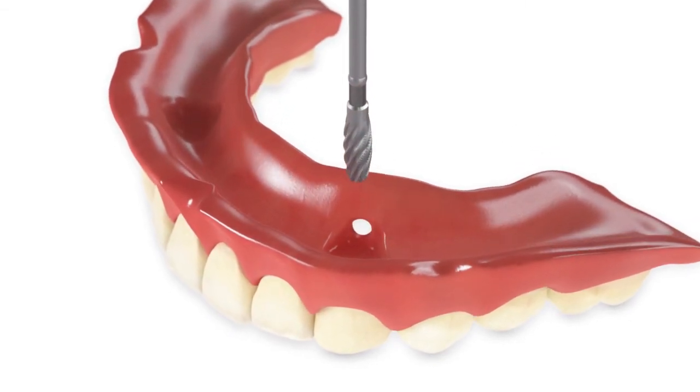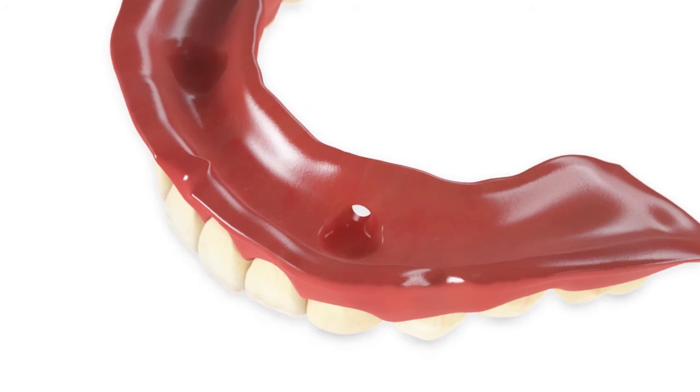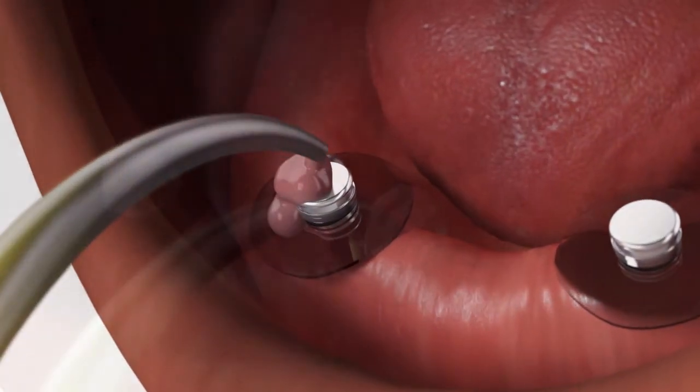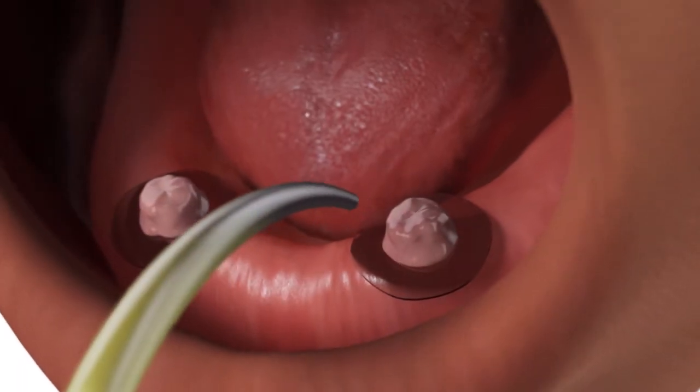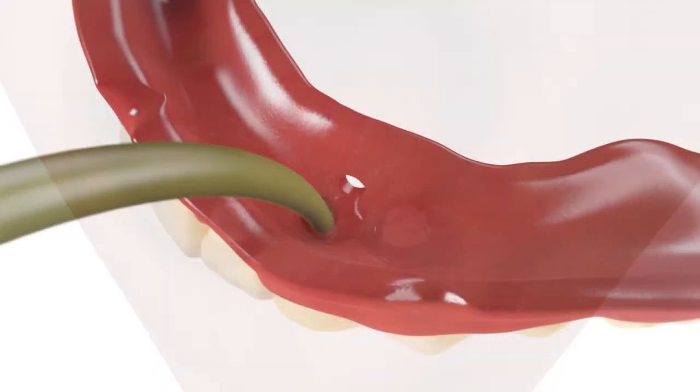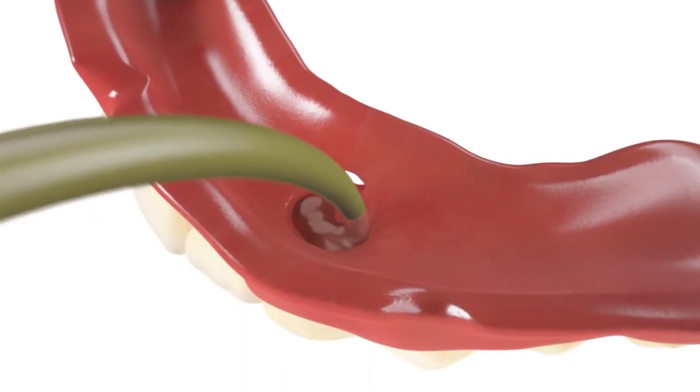Make lingual vent holes to allow the release of excess acrylic. Place light cure or self-curing permanent acrylic around and over the OD Secure housing caps. Place a small amount of acrylic into the recesses in the denture.